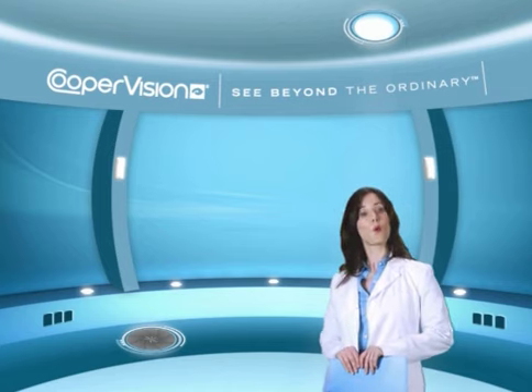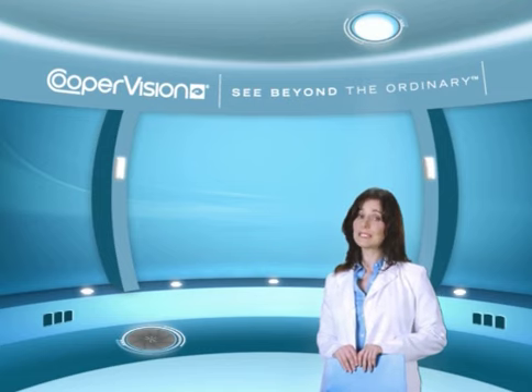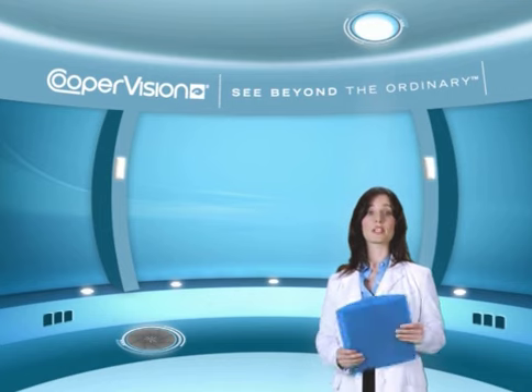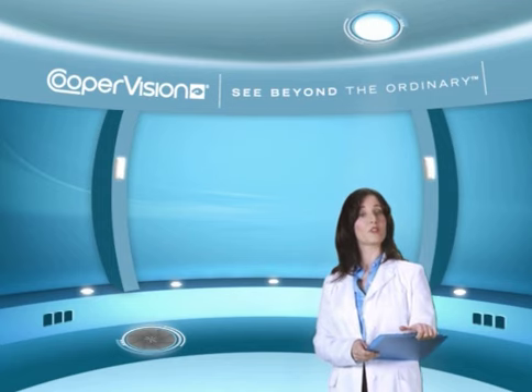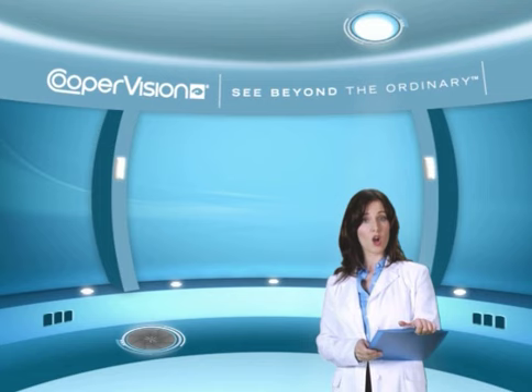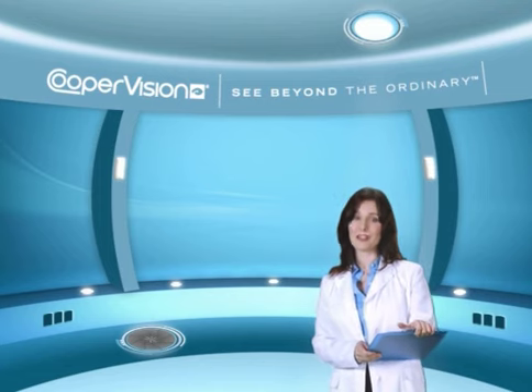We have demonstrated one method of removing your contact lenses — there are other methods. Please consult with your eye care practitioner for the best methods for you, and be sure to follow the lens care procedures they recommend. Follow their advice regarding your prescribed contact lens wearing schedule and dispose of your contact lenses as recommended. This will help to ensure that your eyes remain healthy.